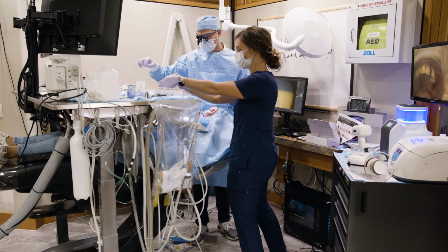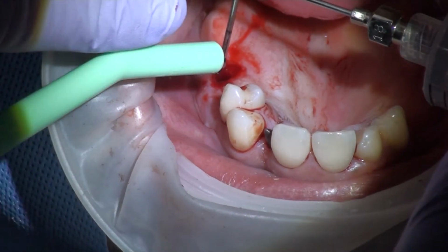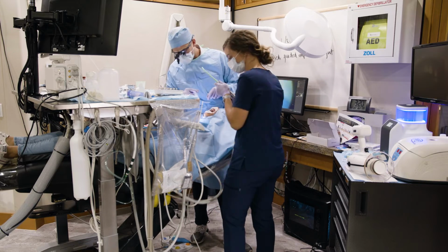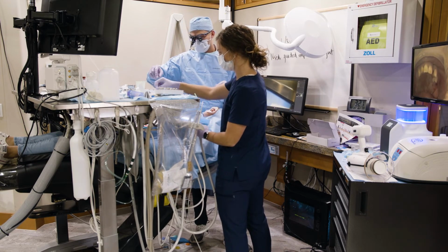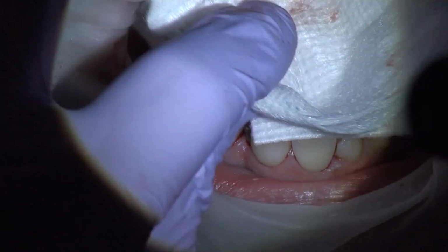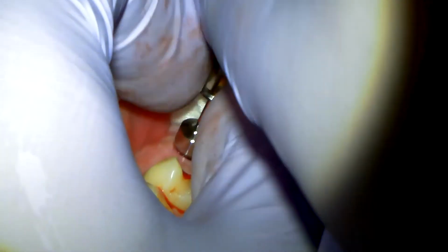I'm going to go ahead and irrigate out inside of these in preparation for the healing abutments. So again, sterile saline. Beautiful. And then we're going to put our healing abutments in there. This is for number 14. Let's take a 4x4. I have one here. Number 14. Here's a little trick. Sometimes I like putting a little 4x4 cotton back here. Acts as a little bit of a blanket to catch anything that might drop.